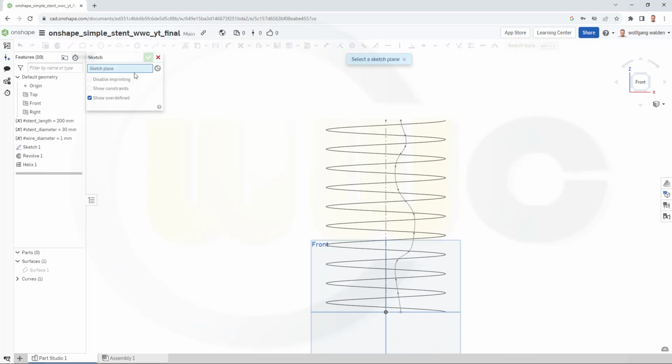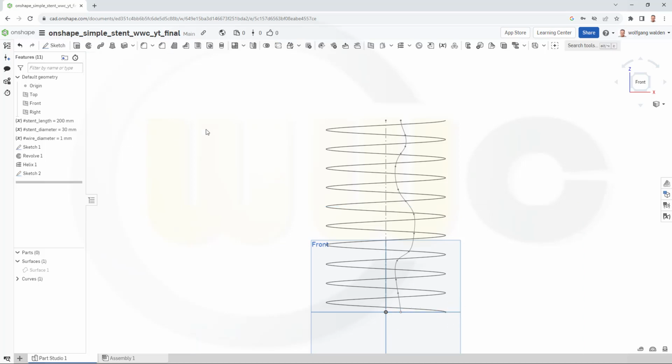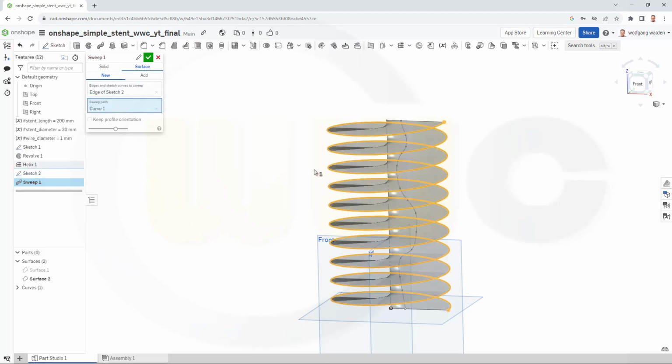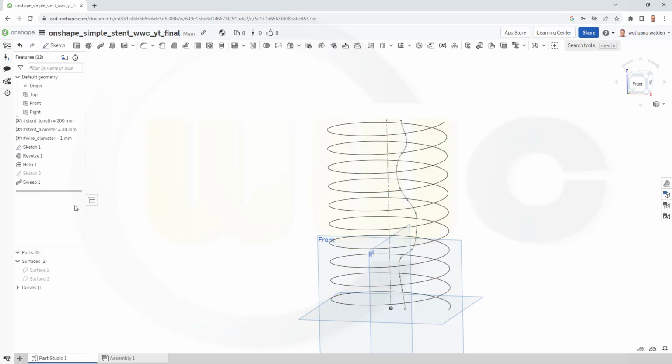Now another sketch on the front plane. I need to bring in that point here, this one here, and I need a line which goes from the origin up to this one here. Okay, and confirm. And now I want to make a sweep, so go for the sweep. It should be a surface, and I want to sweep that line here along that helix, and confirm. Great.